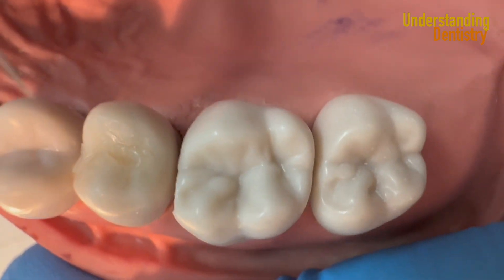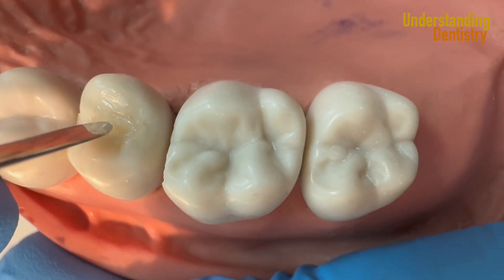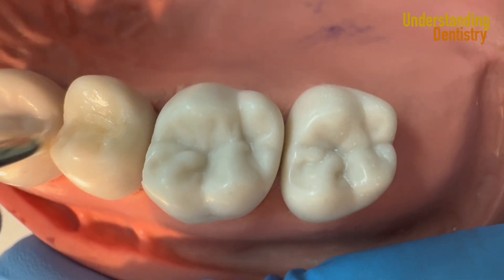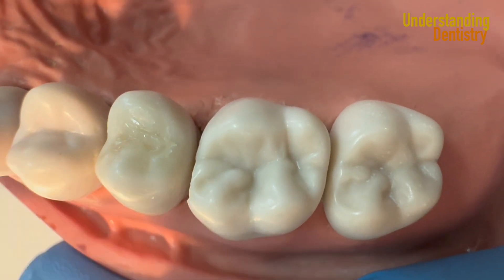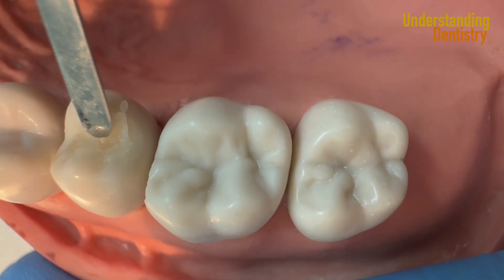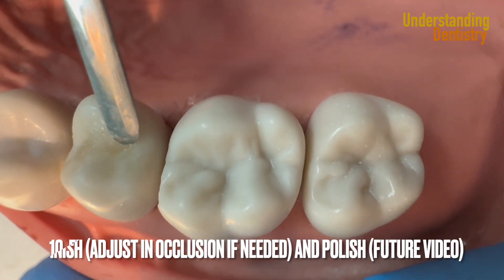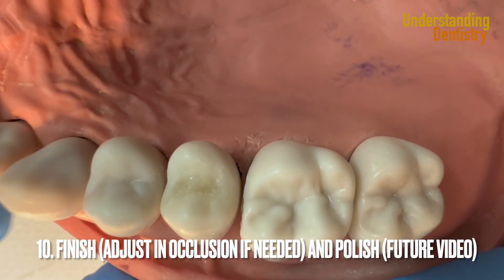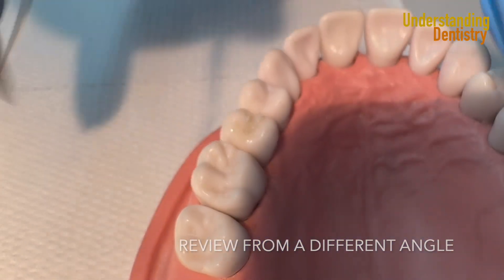Create the anatomy of the fissures and the sulcus, while removing excess and keeping parallel to the existing surface of the cusp. Clean the lateral ridges as well — always with your instrument parallel to the surfaces — and pack the resin inside the cavity as much as possible.